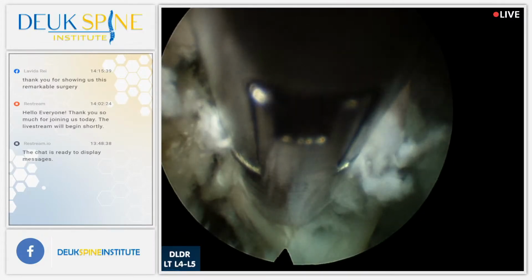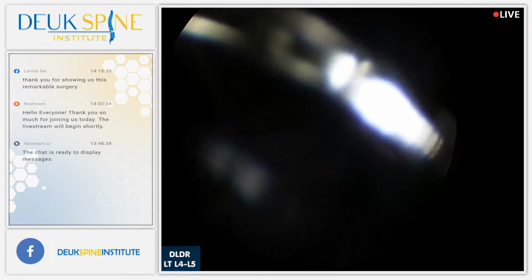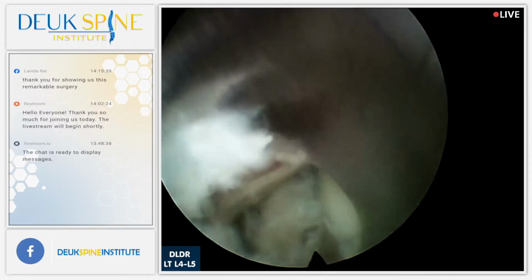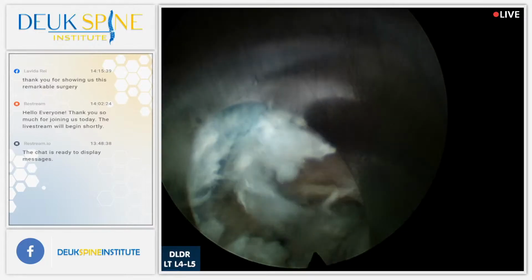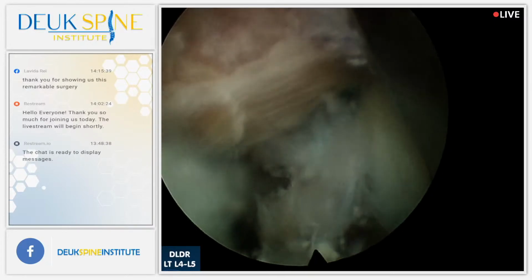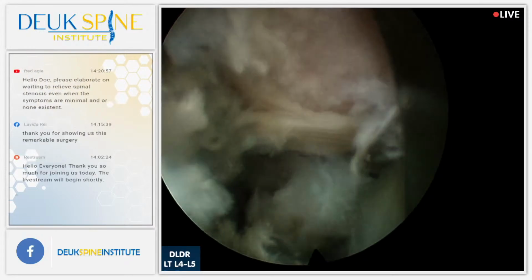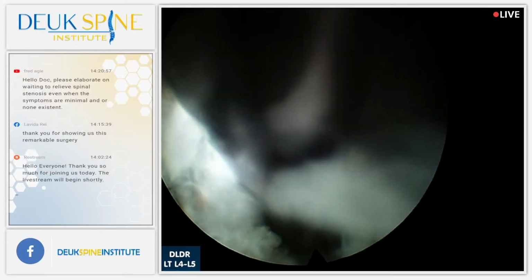Still pulling out pieces of herniation. You can see another one there. That's a good one. In the end, the way I see it, it's all part of God's plan. And we just have to go with it. Make the best of what we can.